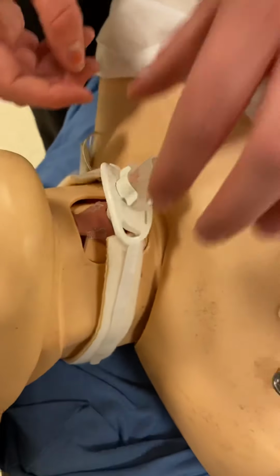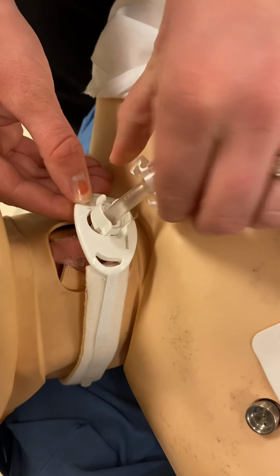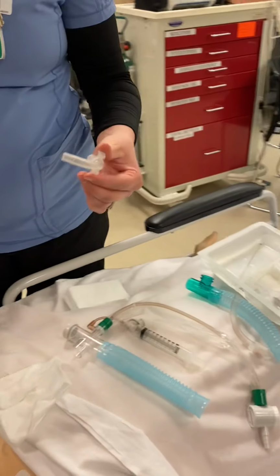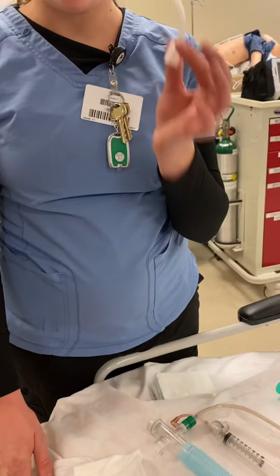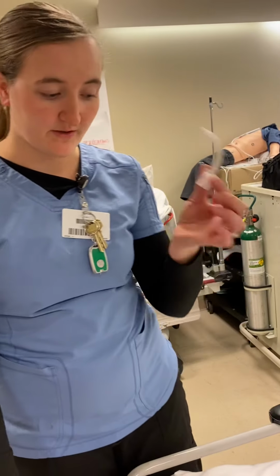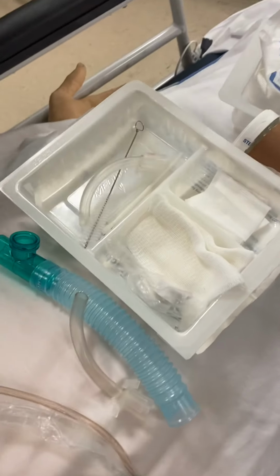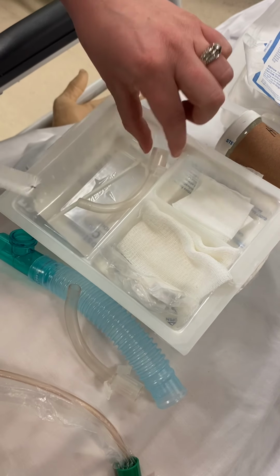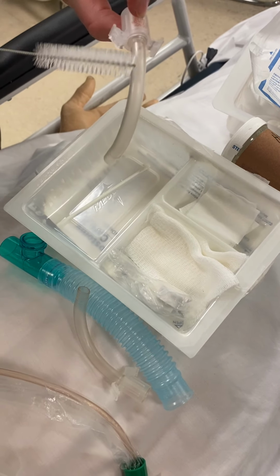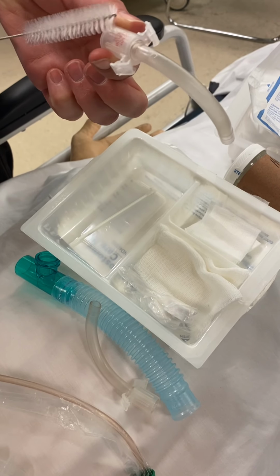Then I'm going to take out that inner cannula. You're just going to pop and kind of twist and pull out. If the patient is desatting, you can put the oxygen back on at this point. They still have an open airway. Then you're either going to discard and get your new one, or you're going to clean. If you're cleaning this, you're going to drop it in your solution and let it sit for just a minute. And then this is where you want to be mindful and keep this part as sterile, and don't touch this part, touching only the outside of that inner cannula to keep it clean.